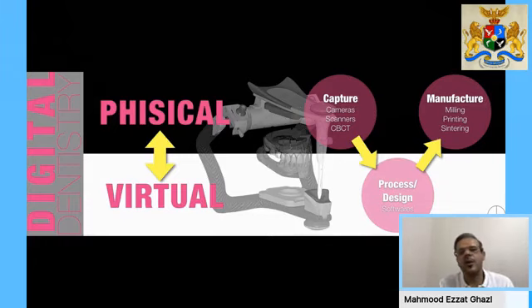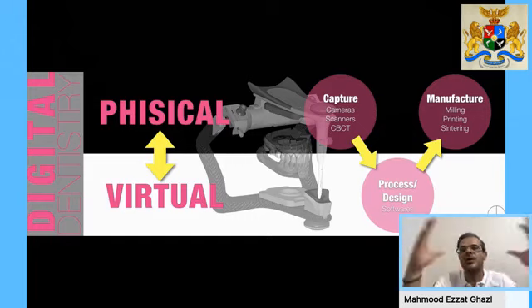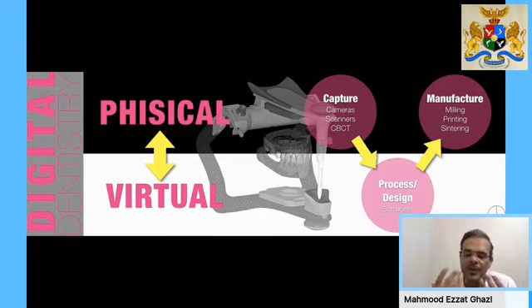And of course, we all now understand how important this is, where you can give an aesthetic proposal for your patient, or it would be impossible to give an aesthetic proposal for your patient without the face in mind. It's exactly like painting, where you're doing a painting and you've drawn something very nice, but it doesn't look good with the background around it. So the teeth are also always part of the lips, they're part of the cheeks, they're part of the face. So the face has to be there so that you can plan correctly where the teeth should be according to the face, what we call a facial driven treatment plan.